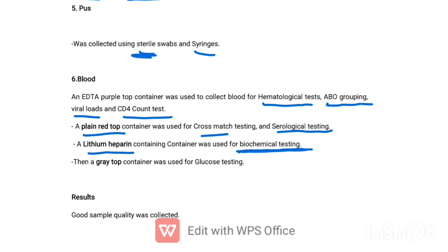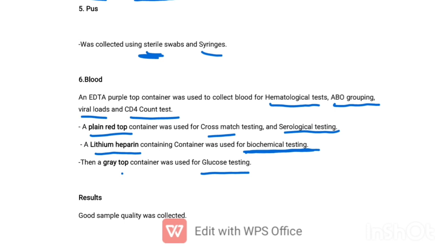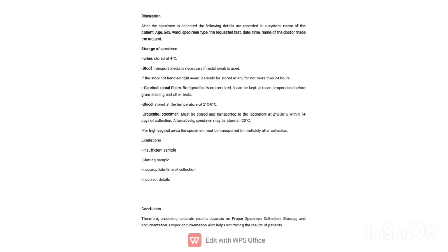And then we use a gray top container, which is specifically for glucose testing. So when we use the appropriate container, the appropriate method, and give the correct instruction to the patient, we can collect a very good sample from the patient.